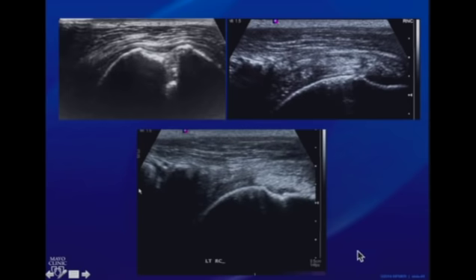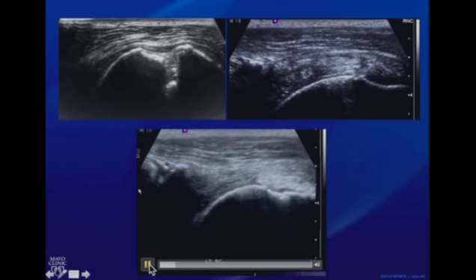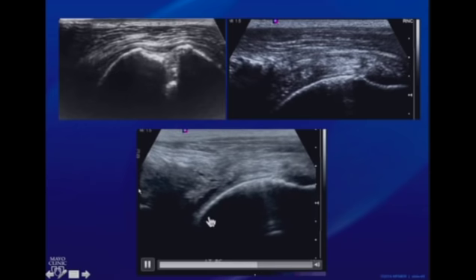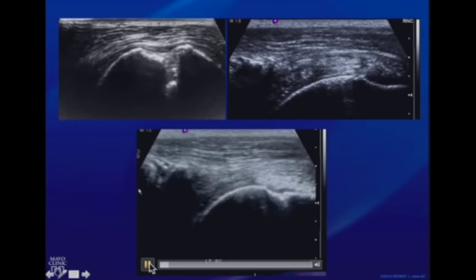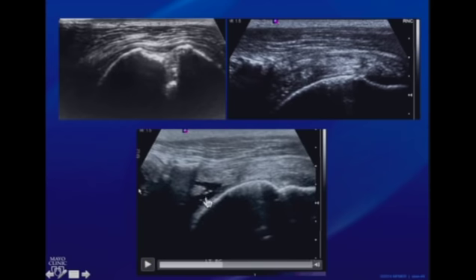So we decided to abduct the arm, and if you look at the abduction, concentrate here at the point where we had a little bit of a suspicion of fluid, and we see that there actually is a full thickness tear. Now this was not apparent on the exam when we started it, but once you abduct, you realize that this is joint fluid communicating through the entire cuff.